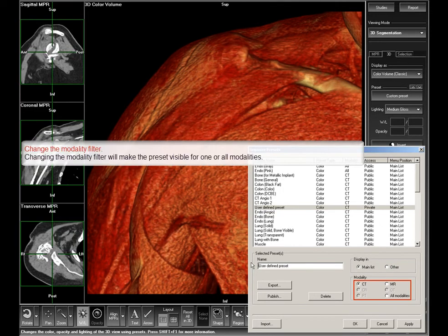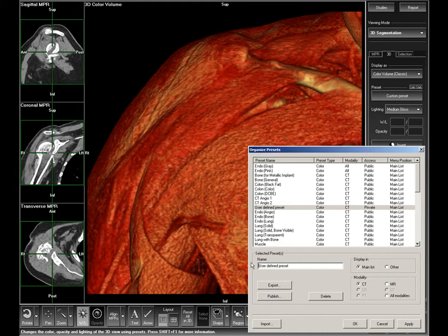By checking CT, MR, or modalities, you can choose whether the preset will appear when CT or MR images are displayed, or regardless of the modality type of the images.